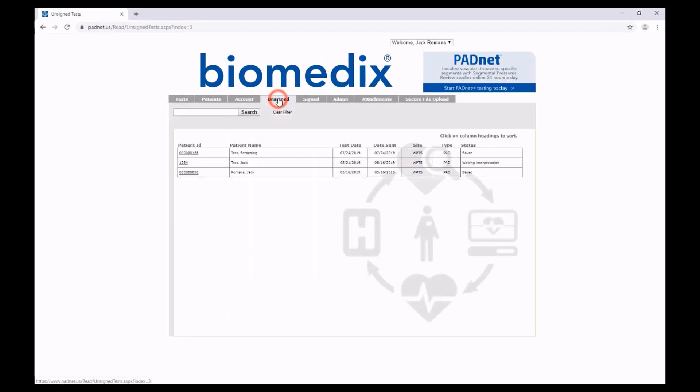From here, you will go to the Unsigned tab, and it will have a list of all of your patients awaiting interpretation. From here, you can see the name, the date of the test, the data was submitted, the site it came from, the type of test, and the status.